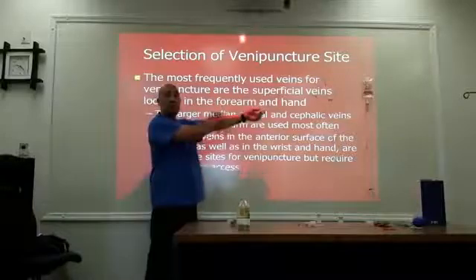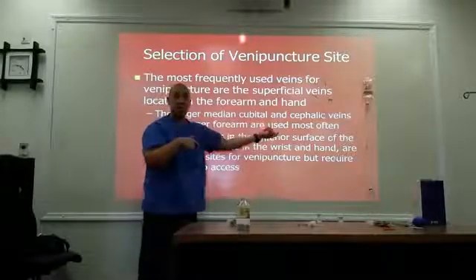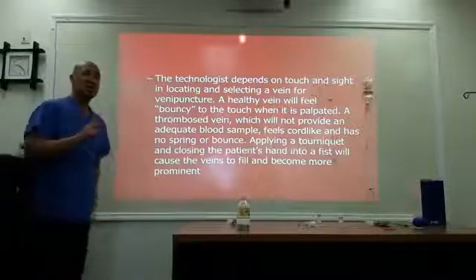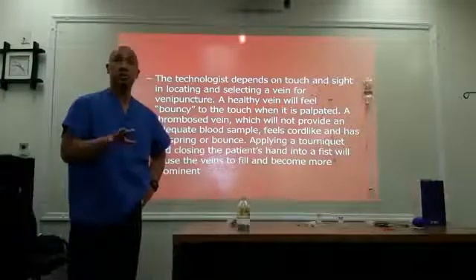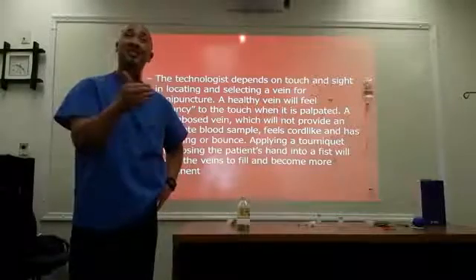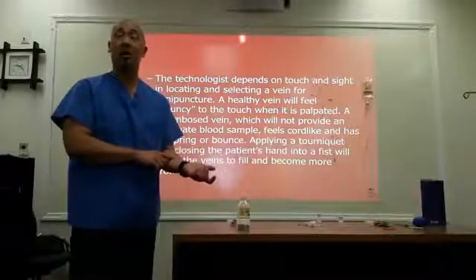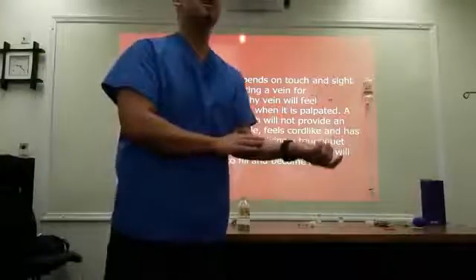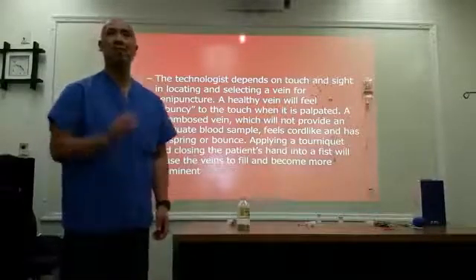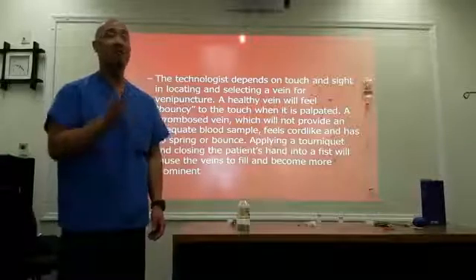What we're going to stick is the crease of your elbow. This is where the cubital or antecubital and cephalic veins are located. This is the best area to stick, if you have good veins, of course. As a technologist, you're going to depend on feel, which is touch, and also sight. You should be able to see the veins. If you don't see the veins, you can see the flow of blood. They may not be raised, but you can still see the vein based on the color on that particular part of the skin. And you also go by feel. The vein should feel bouncy to the touch. If it's hard, if it's coarse, you don't want to touch that because that usually means it is a thrombosed or blocked vein. You're not going to get anything through that. So a good healthy vein must be bouncy to the touch.